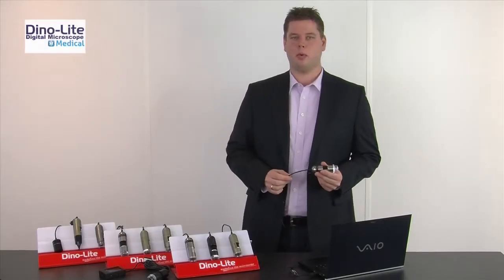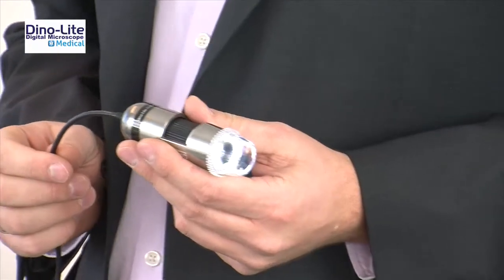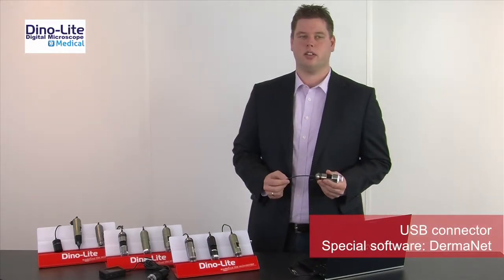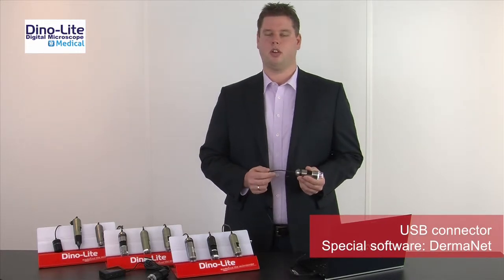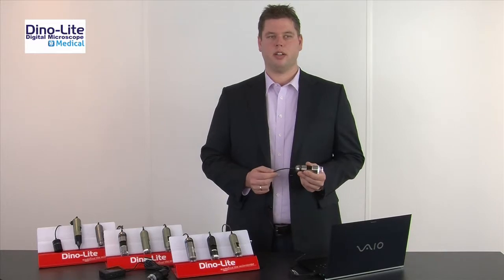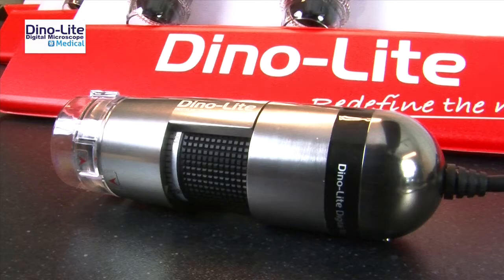The Dynolite Digital Dermascope is a robust and handheld digital dermascope offering superior image quality. It connects to the USB port of the computer and comes with a dedicated software suite for dermatologists called Dermanet. Together with the software, the Dynolite Dermascope is a great tool for a quicker and better diagnosis of your patient.